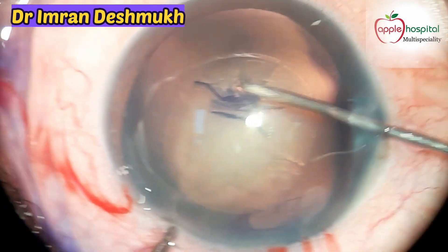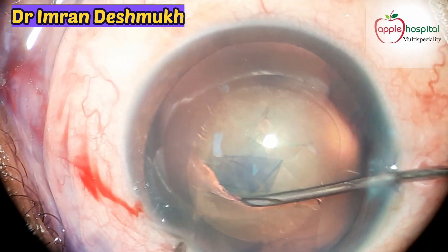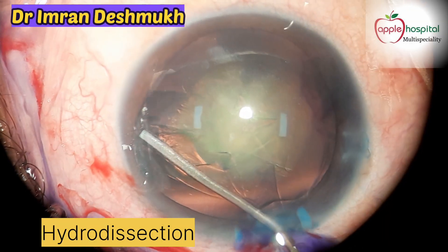Be slow and steady during this step — this is one of the finest and most important steps in phacoemulsification cataract surgery. A round capsulorrhexis has been made. Now it's time for hydrodissection; a 27 gauge cannula is used.